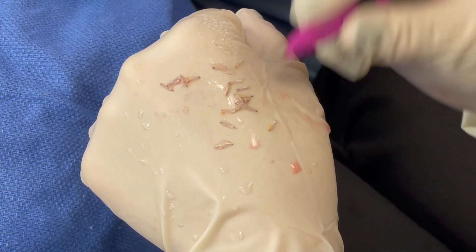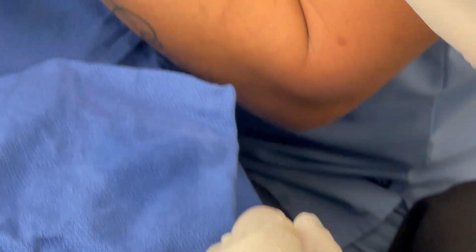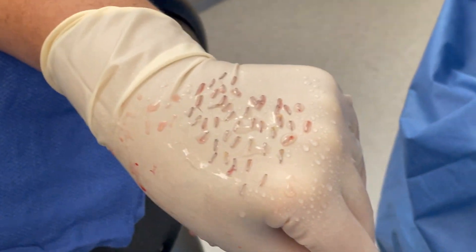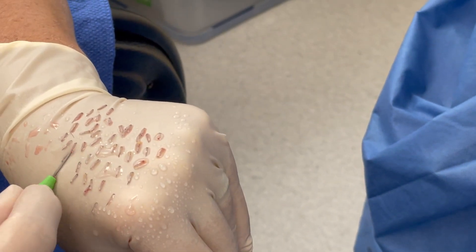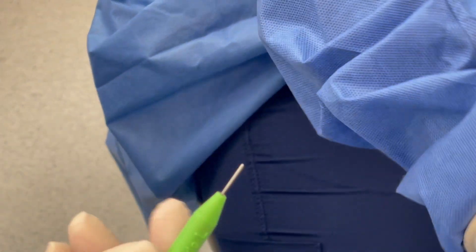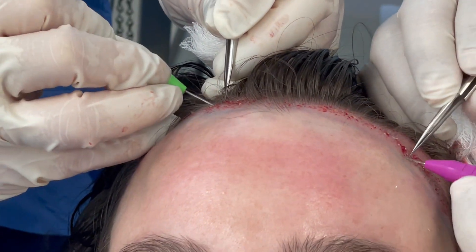You can see how Monica is loading a graft into the implanter, and then it's ready to be handed off to Jose. Similarly, Lourdes has her grafts lined up, also kept moist, and you can see how she is loading the graft ready for handing off to Carmen, who will then go ahead and implant them.